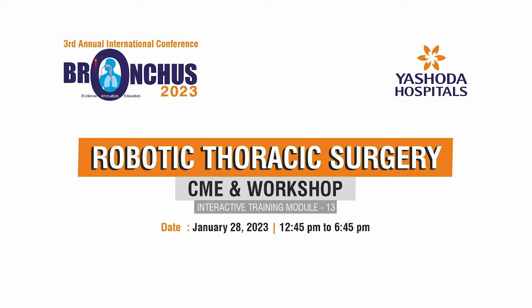I saw your video. You go from the fifth intercostal space. Diego and I have started doing uniportal robotic surgeries. I feel that the seventh intercostal space is a better approach. What do you say? You saw the view. Yeah, yes, yes. Exposure, good approach to the hilum. Yeah. I would like to continue using the fifth or sometimes the sixth.